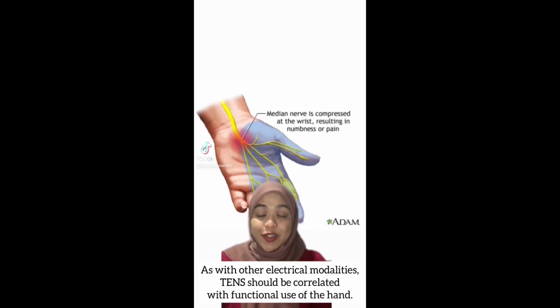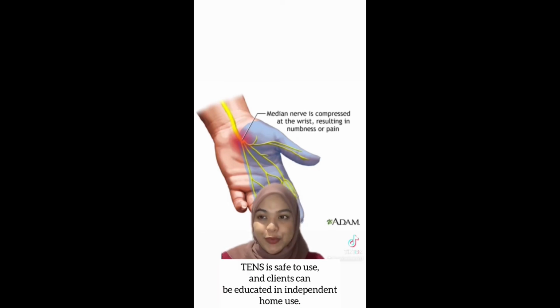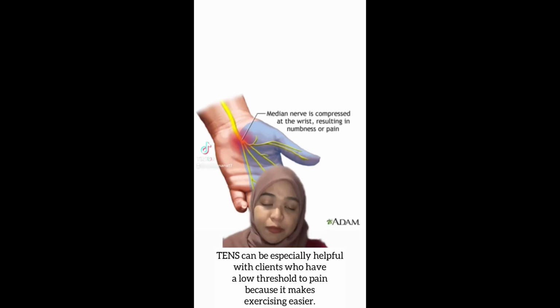As with other electrical modalities, TENS should be correlated with functional use of the hand. TENS is safe to use, and clients can be educated in independent home use. TENS can be especially helpful with clients who have a low threshold to pain because it makes exercising easier.